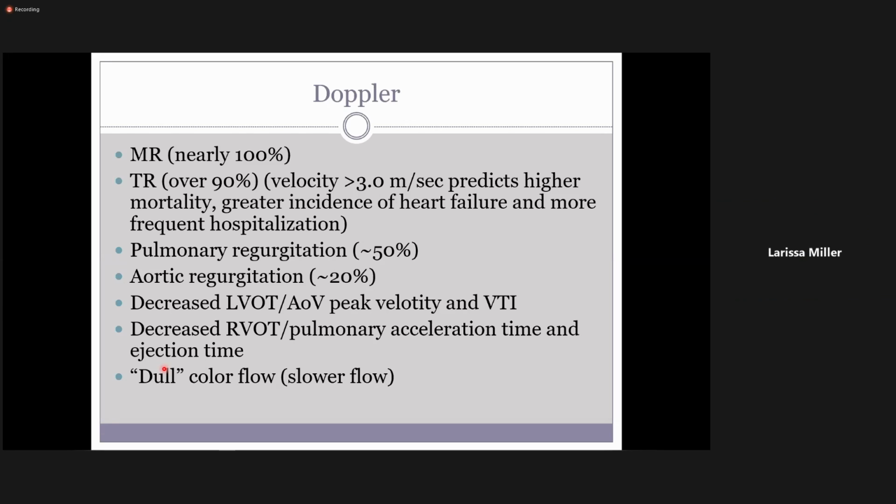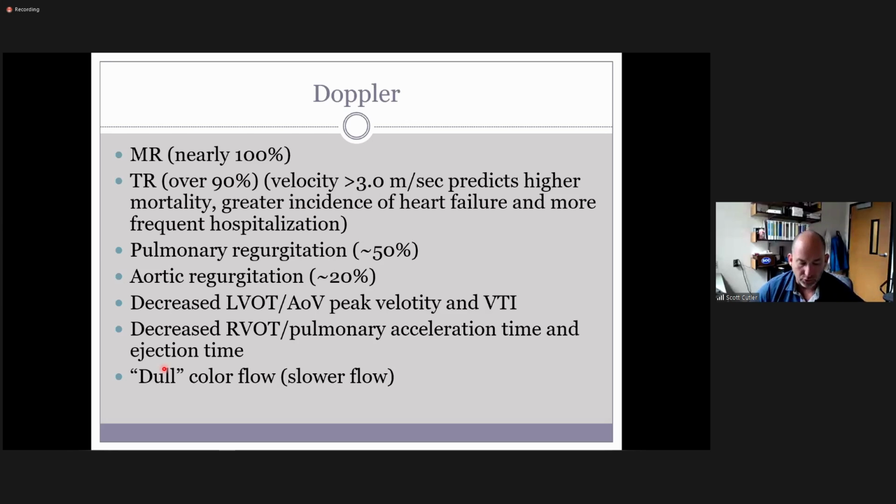So Scott, if you have, and this might be a stupid question, but if you're trying to get in and out of those rooms as fast as you possibly can, would you do like any measurements that you can post-process, like after you've left the room? Yeah, and that's a great point. And a lot of labs actually do that.